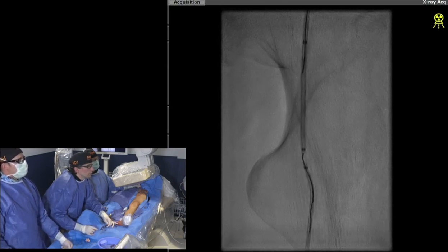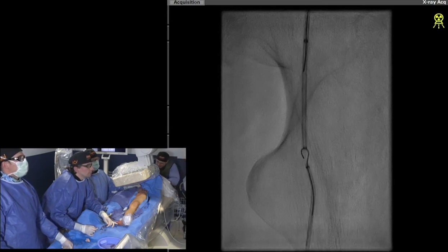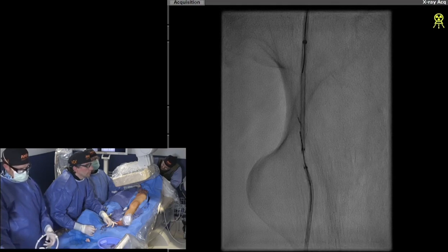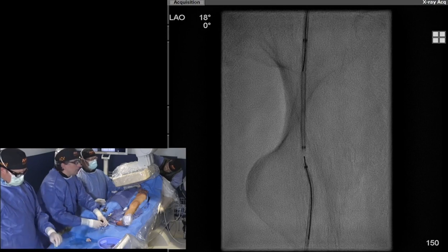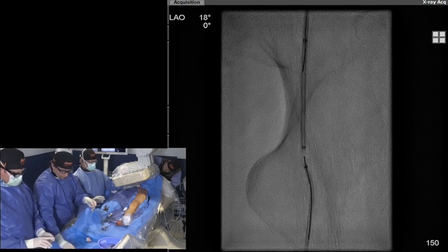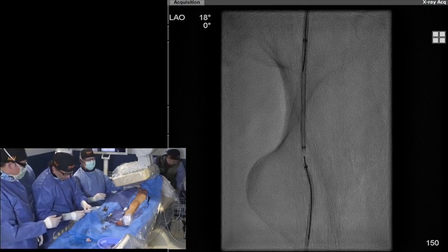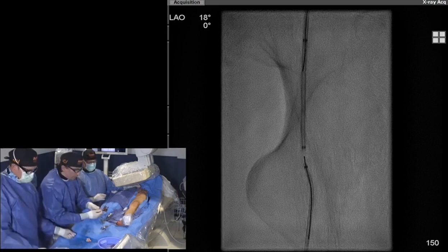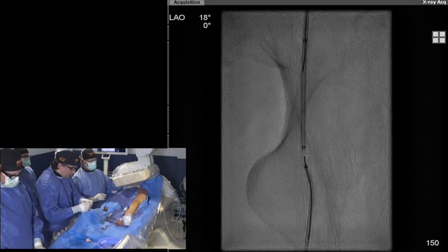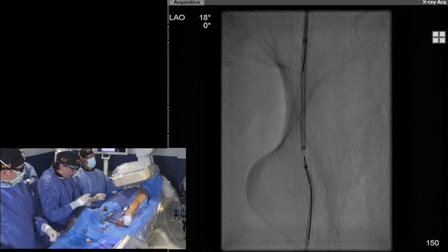See how my wire is touching the catheter? It should enter by now — we're just concerned there's still something in between them. I'm going to switch to an 014 wire as it might be easier. As you're switching, can Ben show us the entry point of the antegrade catheter under ultrasound? We're quite confident that we are through the true ostium of the SFA, as we saw under ultrasound — so it was not a concerning point for us.